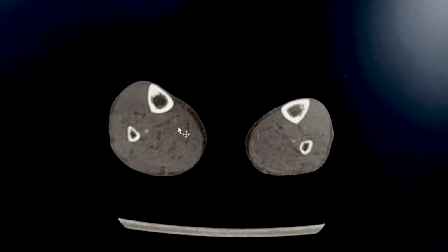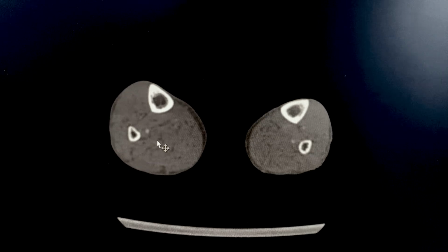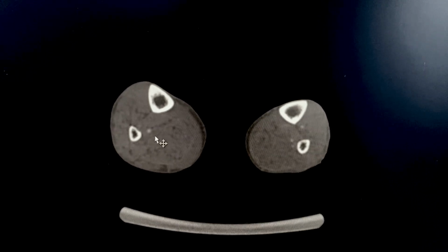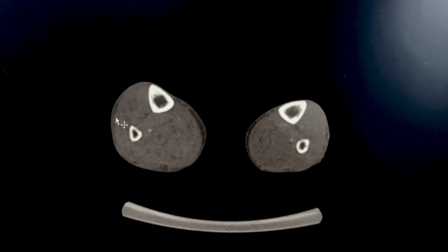And you can see here the posterior tibial artery is occluded and the peroneal artery remains alone, feeding this limb.